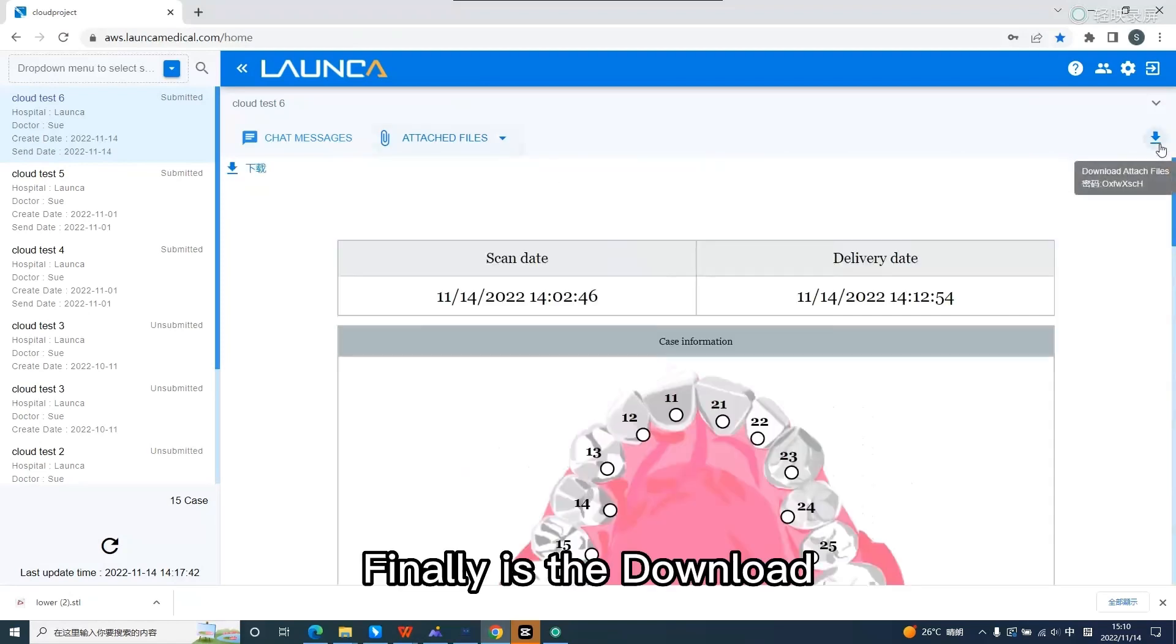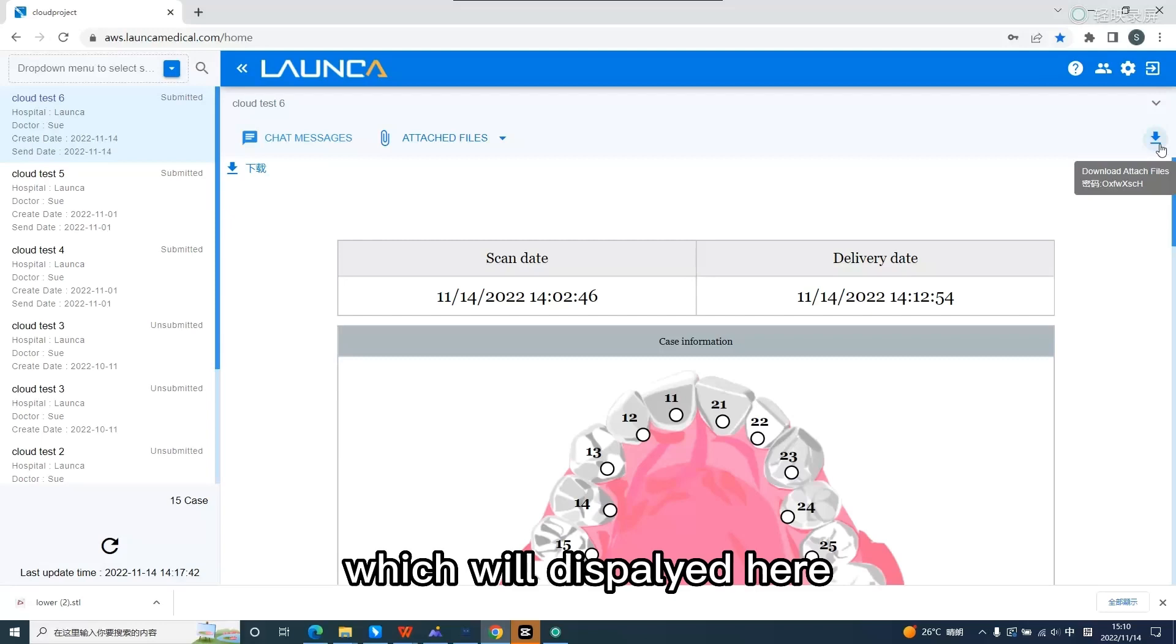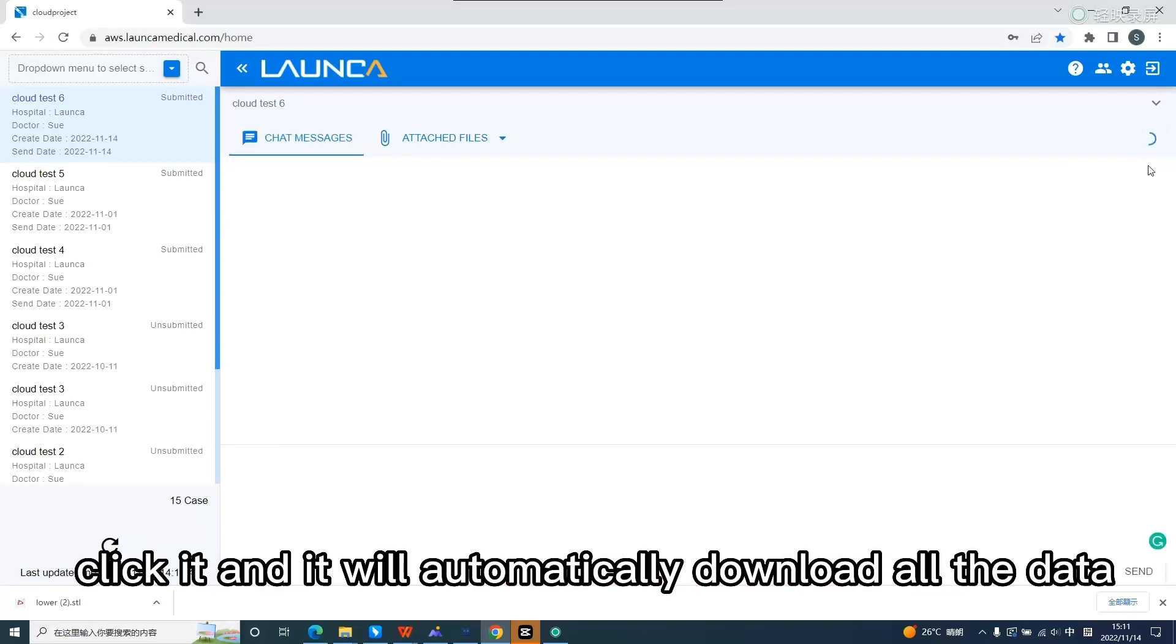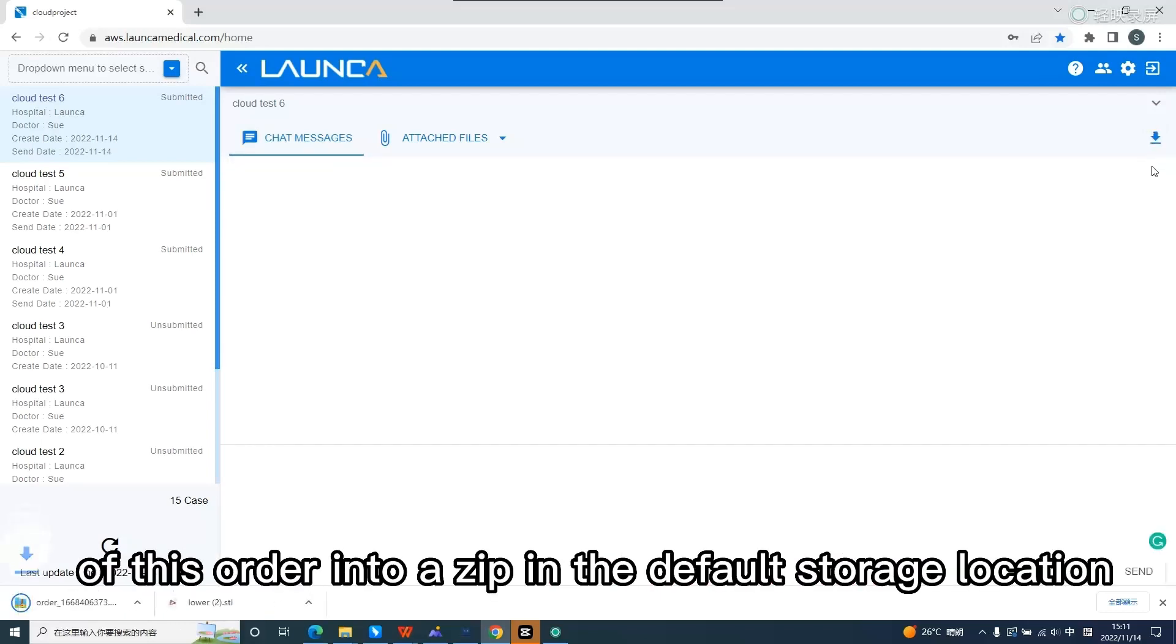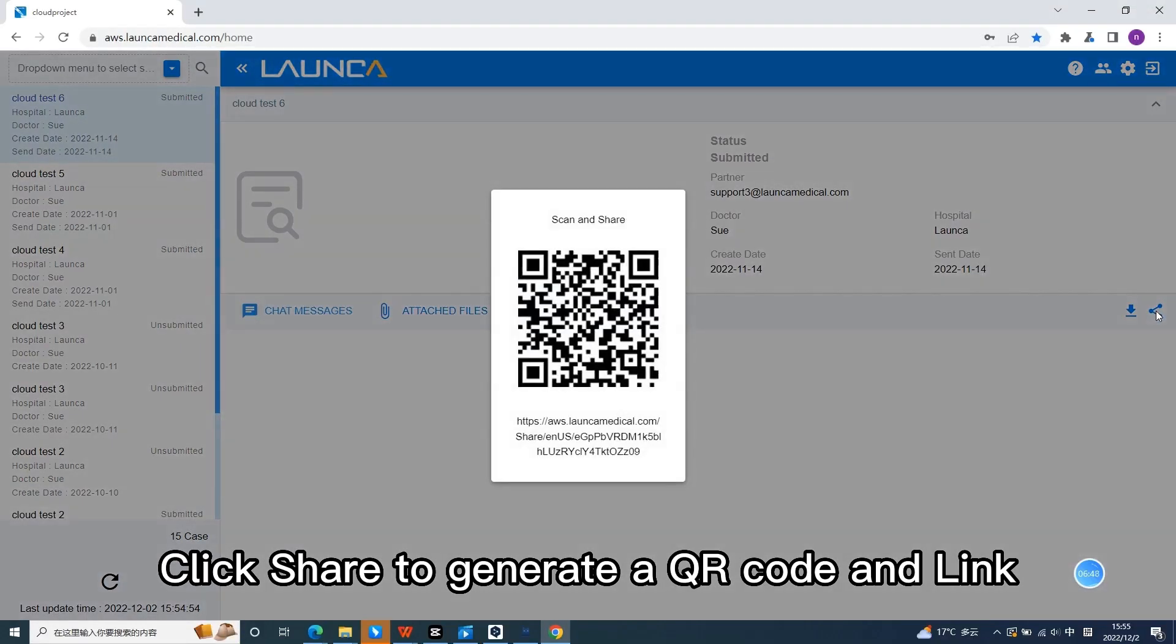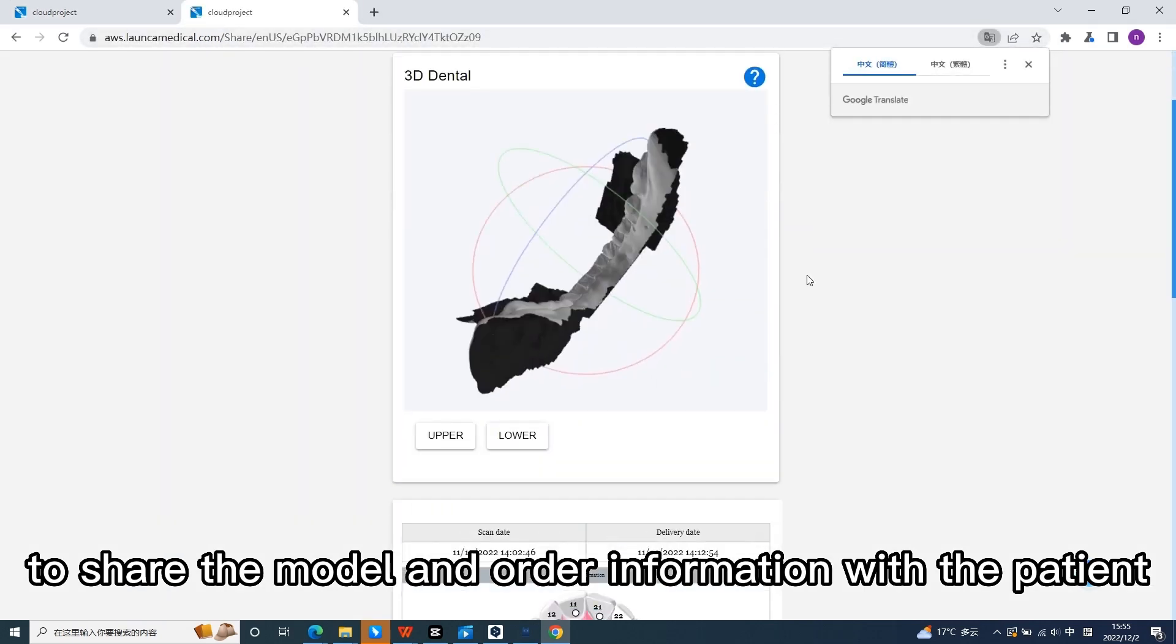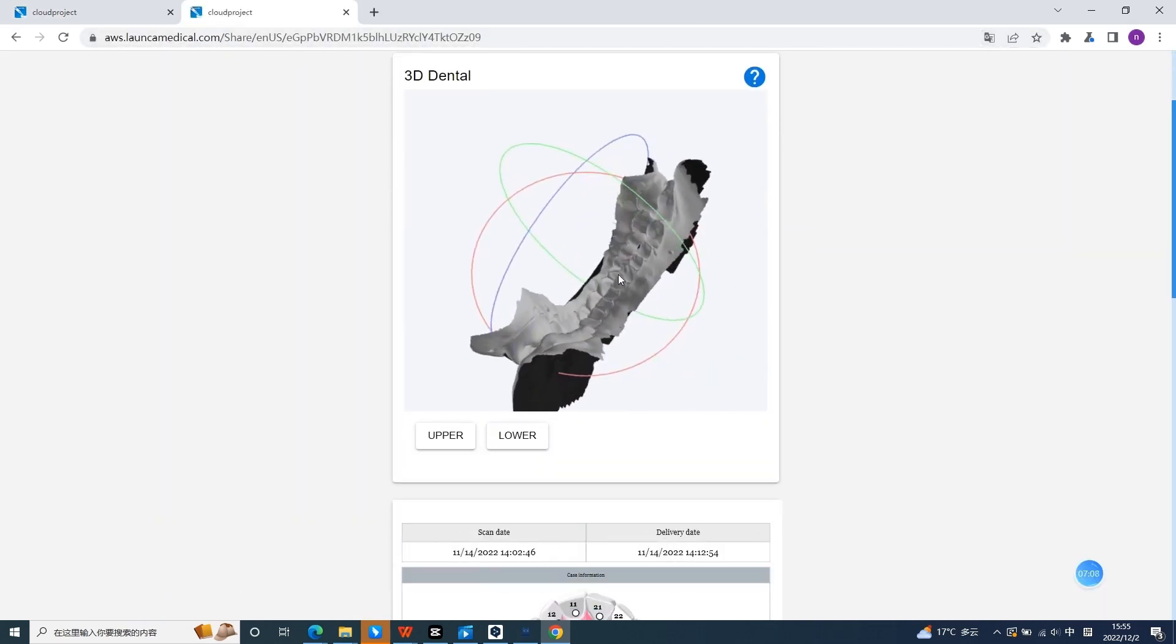Finally is the download. A password is required to open this zip file, which will be displayed here. Click it and it will automatically download all the data of this order into a zip in the default storage location. Click share to generate a QR code and link to share the model and order information with the patient.